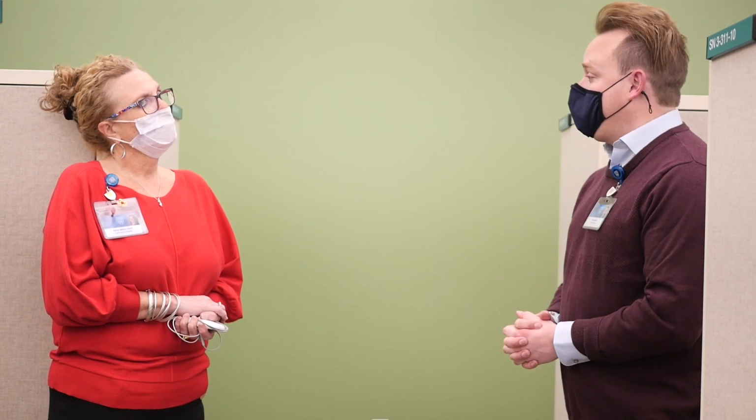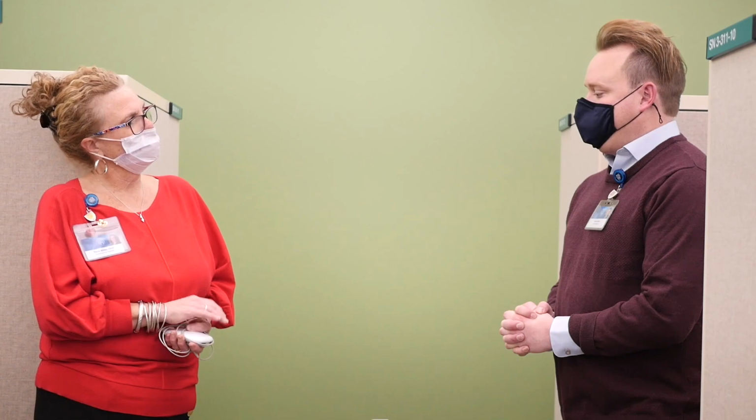So since predominantly the user is an elderly person who wears this, do they normally wear it after surgery, or is it just after a general appointment? A lot of it's after surgery, and a lot of it can be a patient will come into the hospital and just say they feel real fatigued, short of breath. I feel like when I exercise, my heart's going really fast. I can feel it. And instead of keeping them in the hospital and maybe running tons more tests that cost a lot of money, they'll say, let's put you on this monitor for 30 days and see what we can capture. So that takes the place of a lot of tests, because they're going to watch their heart for that 30 days and see what's going on.